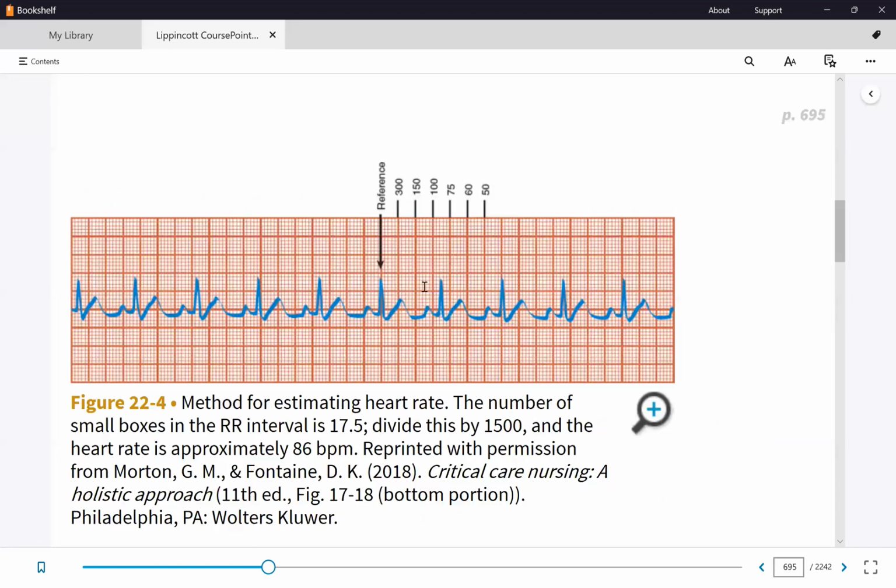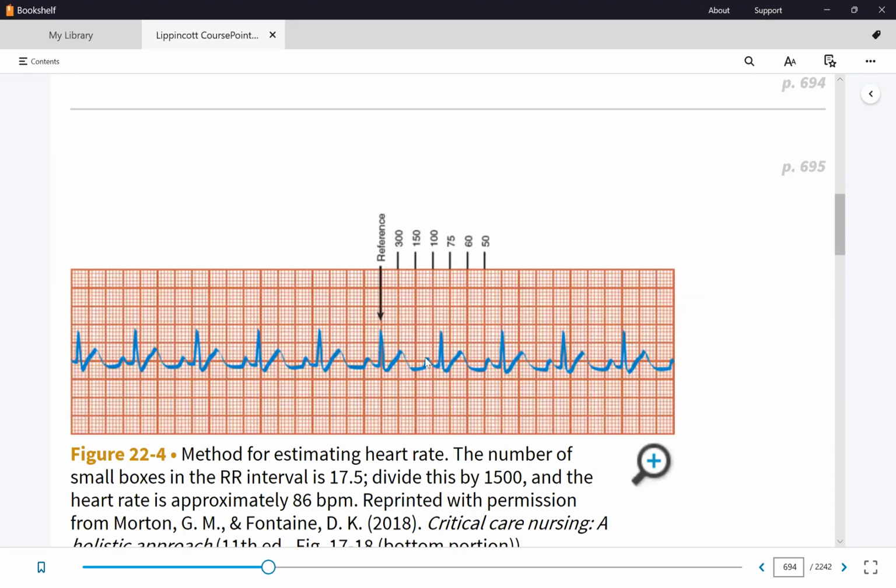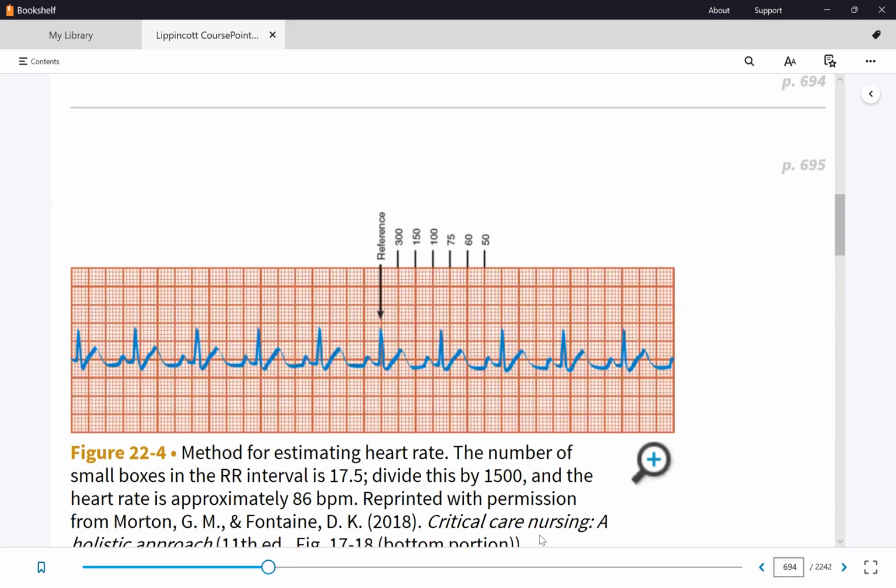So there are many methods again. So let's start with one. What is one cardiac cycle? What should we see in one heartbeat? We should see one set of PQRST, yeah? So we see one PQRST, that's one heartbeat. Since this is time, let's create our 3-second markers. The good thing about 6 seconds is whatever number you get, you multiply that by 10, that's 60 seconds. So that's your estimated heart rate.